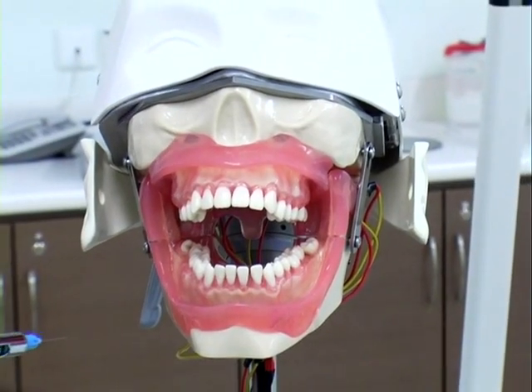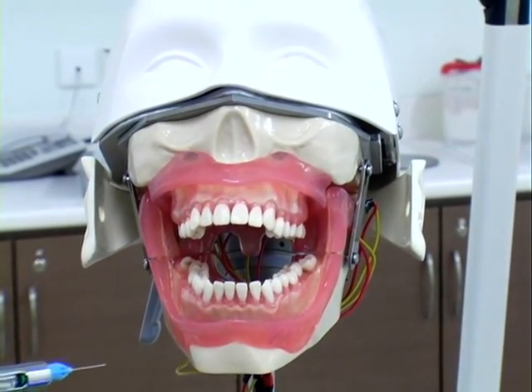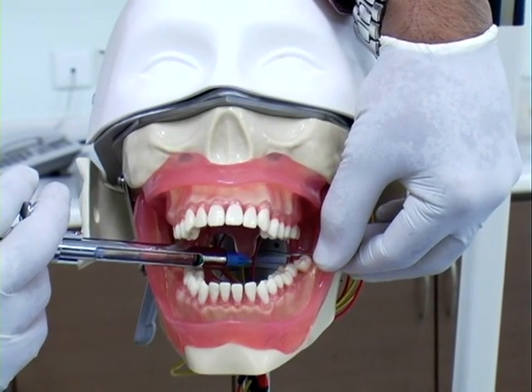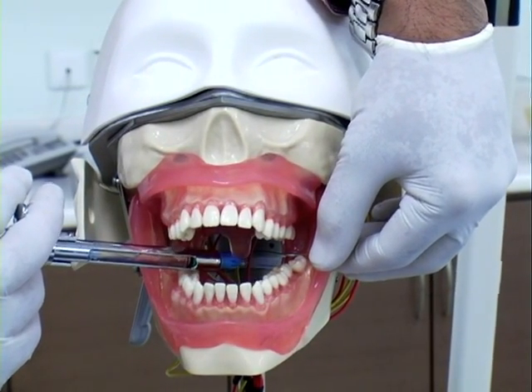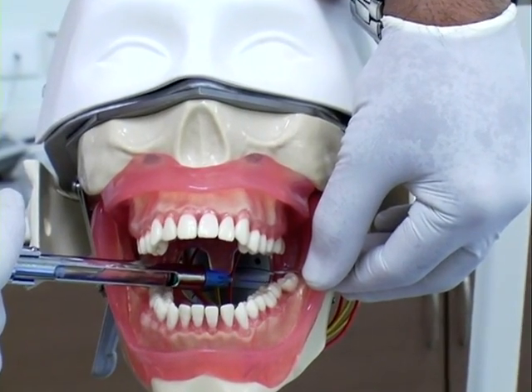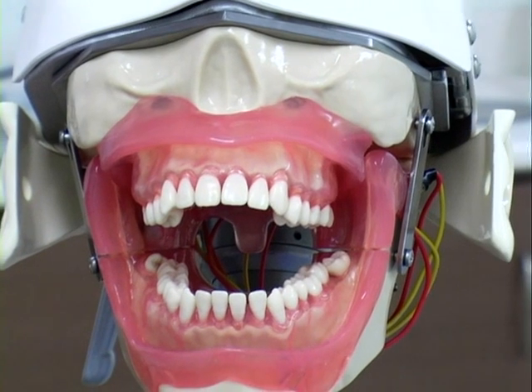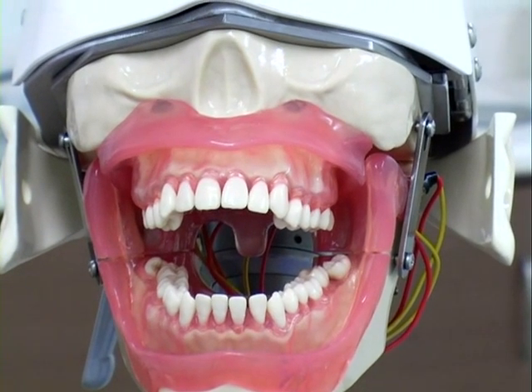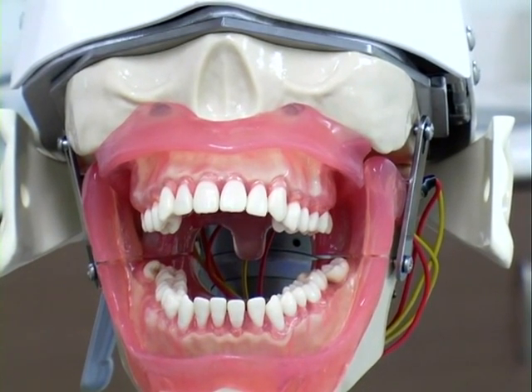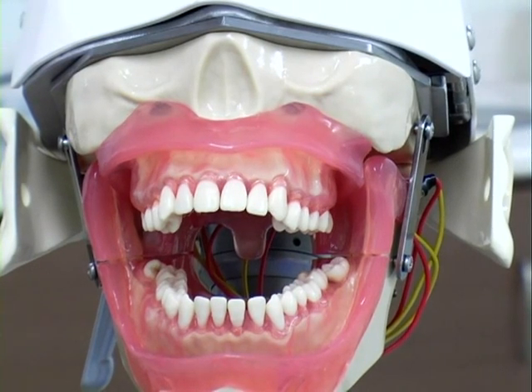We are also going to demonstrate the block of the lingual nerve, which is slightly medial to the lower wisdom tooth. By depositing a few milliliters of local anesthesia in this area, you can easily block the lingual nerve.